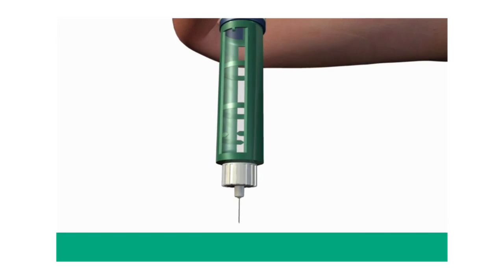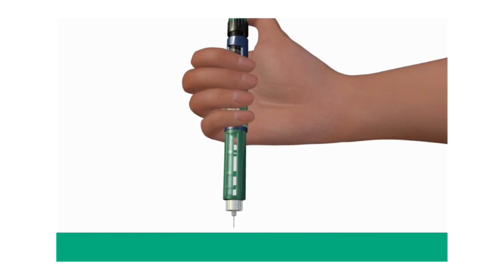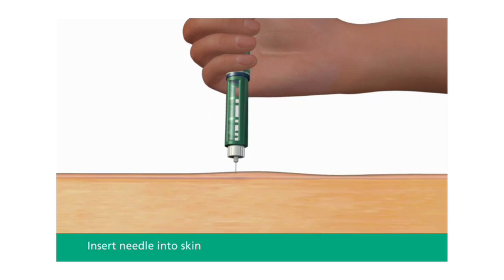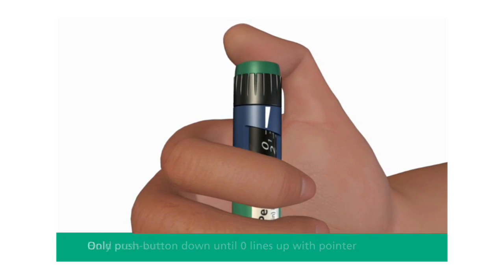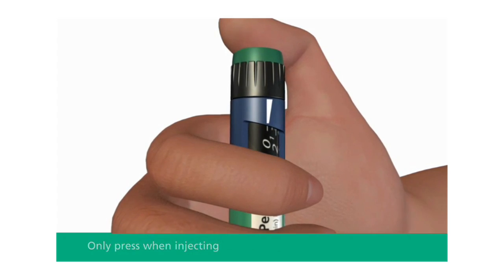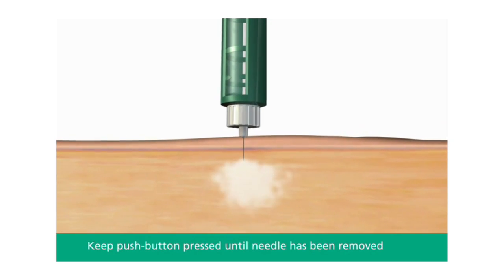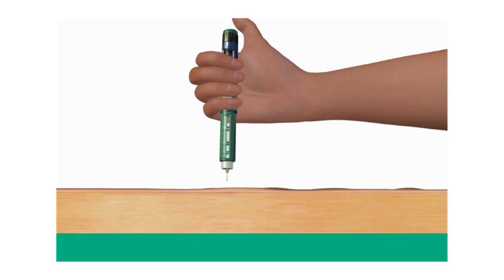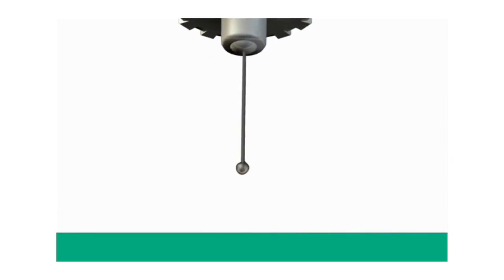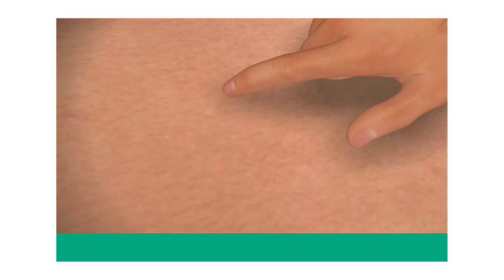Do the injection exactly as shown to you by your health care provider. Your health care provider should tell you if you need to pinch the skin before injecting. Insert the needle into your skin. Inject the dose by pressing the push button all the way in until the zero lines up with the pointer. Be careful only to push the button when injecting — turning the dose selector will not inject insulin. Keep the needle in the skin for at least six seconds and keep the push button pressed all the way in until the needle has been pulled out from the skin. This will make sure that the full dose has been given. You may see a drop of Levemir at the needle tip or on the skin; this is normal and has no effect on the dose you just received. If blood appears after you take the needle out of your skin, press the injection site lightly with a finger. Do not rub the area.